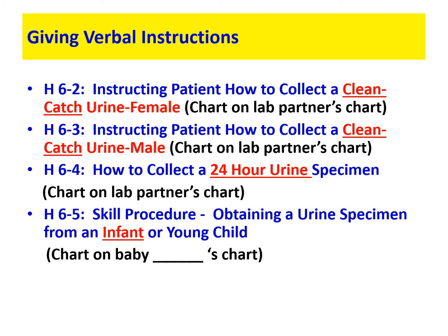Ask for their full name and date of birth and make sure you're comparing their name and date of birth to the requisition form, okay? Then we always want to do our medical interview. Want to ask them if they're on any medications. Have they exercised strenuously in the last 48 hours? And did your doctor ask you to follow any type of special diet or fast before having your blood drawn or having any tests done, right?